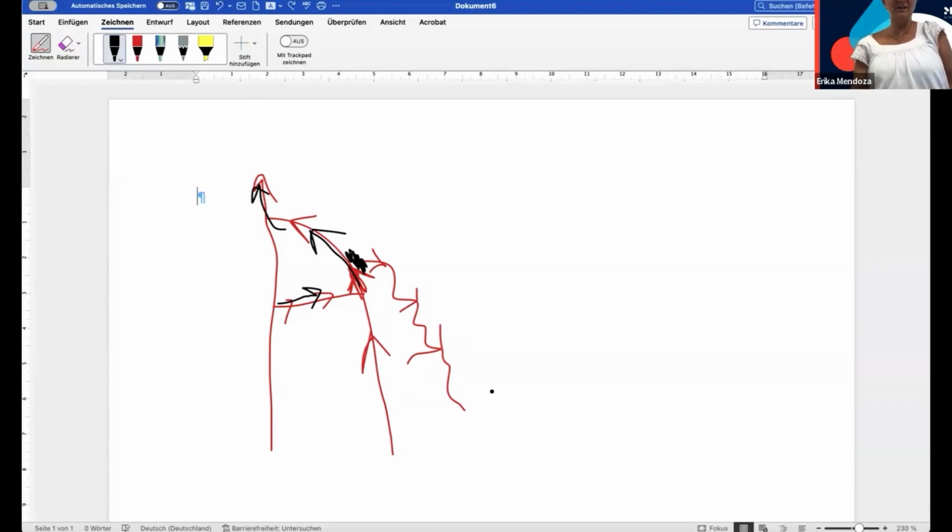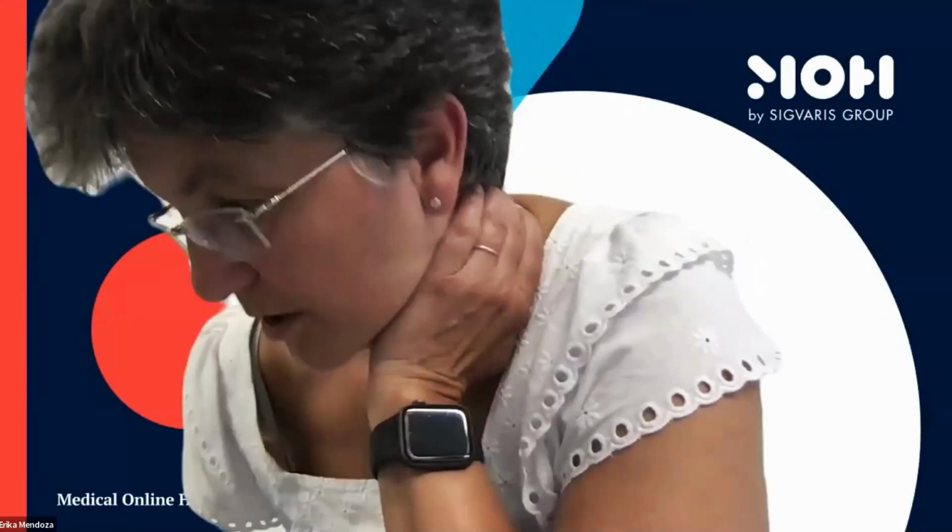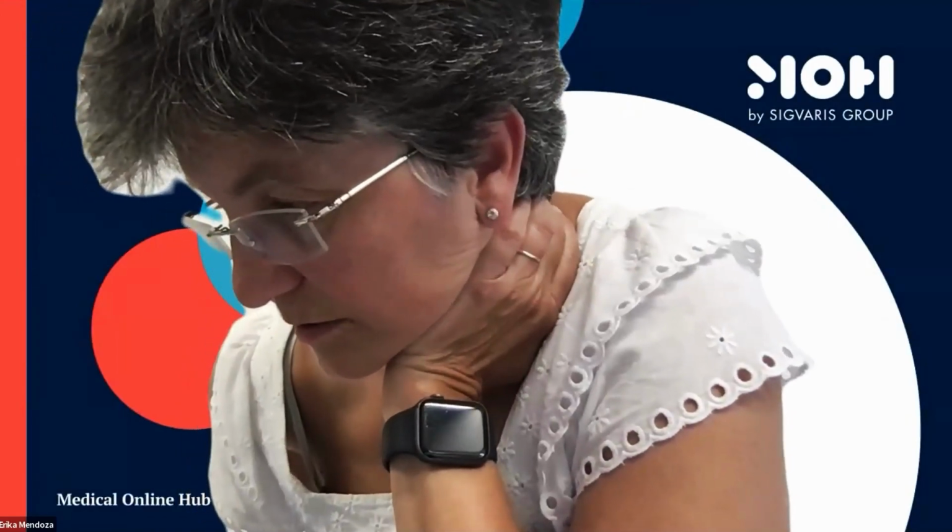But now the image has been clearly seen, yes? Thank you, Erika. It's very interesting because this is our really daily life practice. I wish to ask you about the treatment in this case. What would you like to do for this patient if he has a tributary incontinence where the reflux comes from the perforator? What would be your treatment for such a scenario?